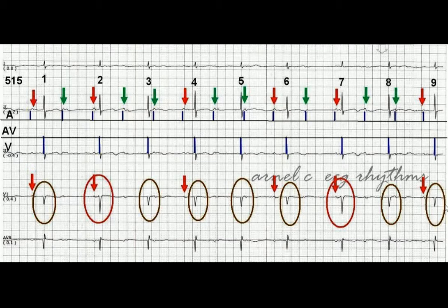QRS marked in red, which are 2 and 7, have a larger amplitude compared to QRS marked brown. The RR interval, R1 and R2, and R6 and R7, is about 1.36 seconds. This is different compared to the QRS marked in brown, which has an RR interval of about 1.16 seconds. There is a P wave with a PRI of about 0.12 seconds. The conductable distance of the P wave to the QRS, together with the difference in QRS morphology, and the difference in the RR interval, would support the concept that QRS 2 and 7 are coming from the sinus node, or these are called captured beats.